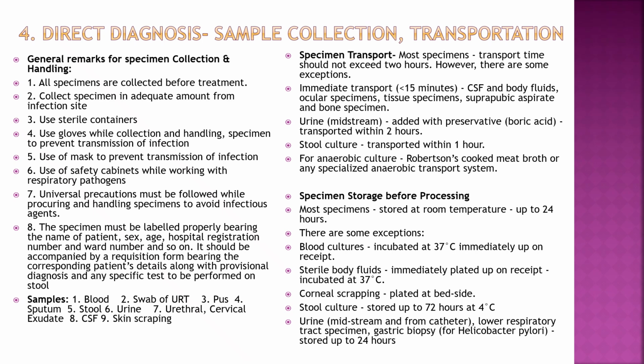The specimen must be labeled properly, bearing the name of the patient, sex, age, hospital registration number, ward number, etc. It should be accompanied by a requisition form bearing the corresponding patient's details, along with the provisional diagnosis and any specific test to be performed on the sample. Samples are blood, swab of upper respiratory tract, pus, sputum, stool, urine, urethral and cervical exudate, CSF, skin scraping, etc.